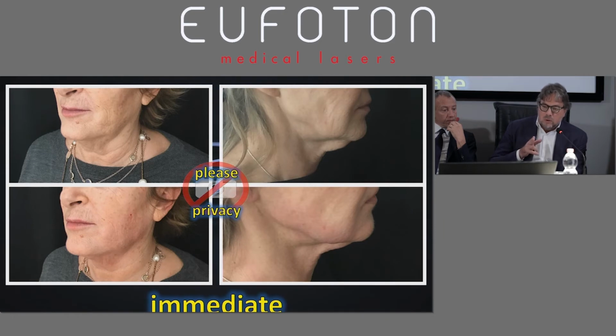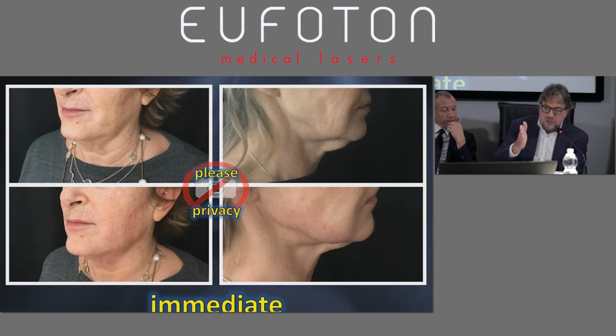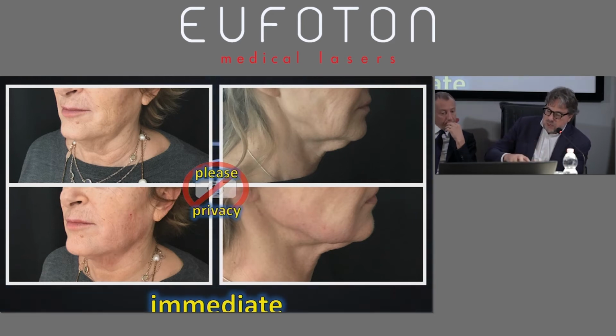So I just work against the deep derma. I'm very superficial. I superficially go with this fiber because what I want to get in the end, that's what Dr. Forte just said a while before, is the 3D compartment. We have to be near the Camper fascia and the fibrous septa, near the fascia, to have some compaction of this district, of this region.